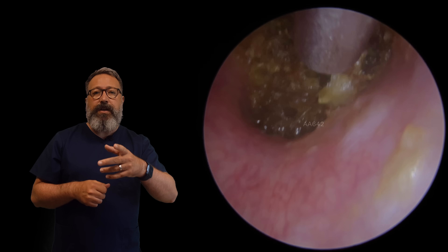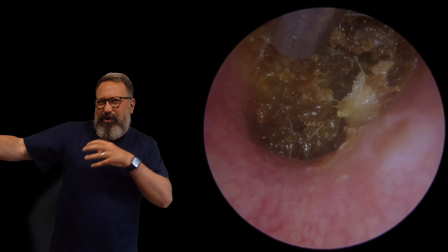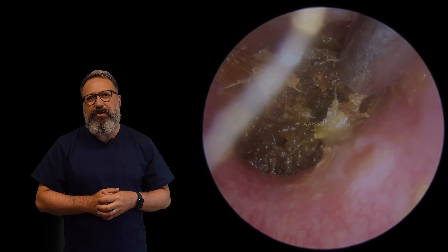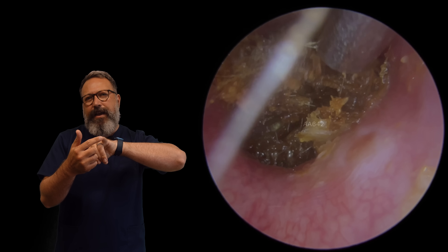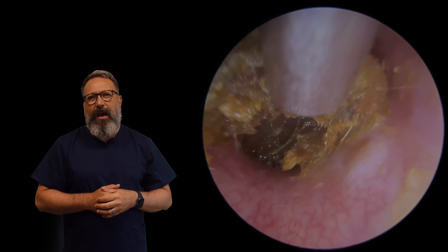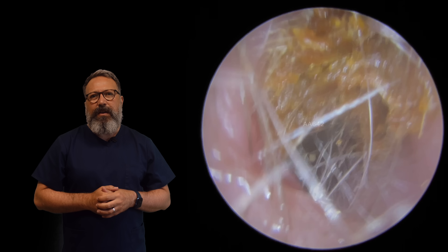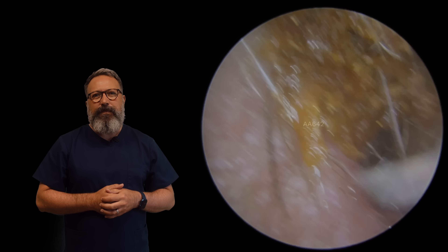If you're interested in knowing the sizes of the tools used, we did a bunch of Shorts on those — I tried to clump them together so it gives you an idea of the size. But for context, take your little pinky finger and look at the end of it — that's the kind of size we're working in at the moment. A very, very small space, and yet a nice big chunk of wax comes away from it. You can see that dry layer that was sitting underneath there.